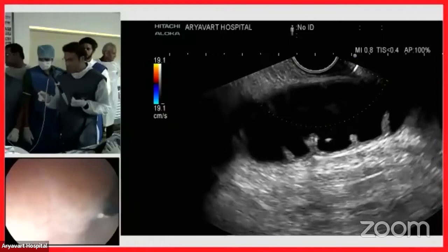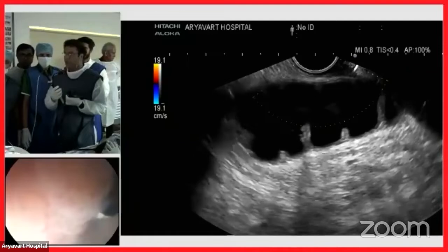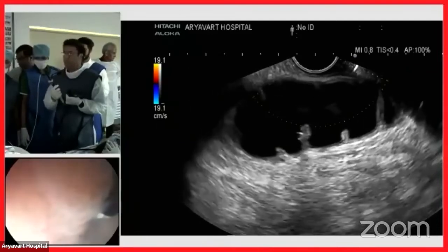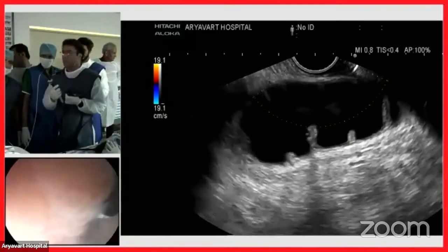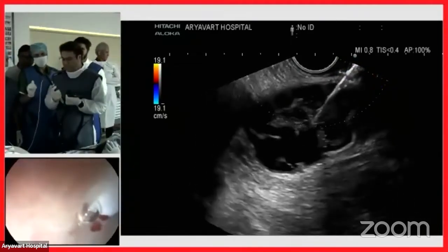400. Okay. Fluid on, please. The cautery settings you use are similar to sphincterotomy? No, this is a pure cut, what we are using. So we are in the bowel. This was the first step.